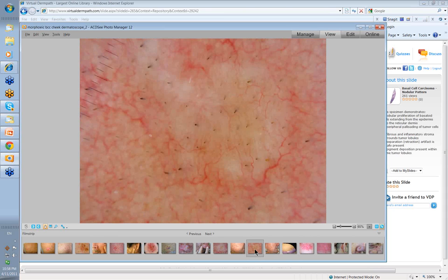But if you in fact put the dermatoscope on it, then this is the background telangiectatic picture that you see on his background skin, but within the lesion itself you see these finer branching serpentine vessels in this pale stroma. And this is part of the picture that you can see. They're much paler, obviously, than, say, that superficial BCC was earlier.